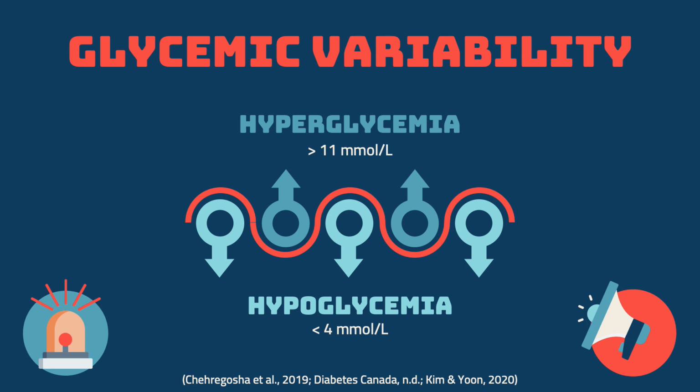Continuous glucose monitoring offers a proactive approach to glycemic control that is unattainable by conventional self-monitoring of blood glucose and hemoglobin A1c data. When blood glucose is trending down, timely identification through continuous glucose monitoring allows patients to take action to prevent hypoglycemia. As blood sugars trend up, patients can modify medication, activity, and food intake to bring their sugars back into the target range.